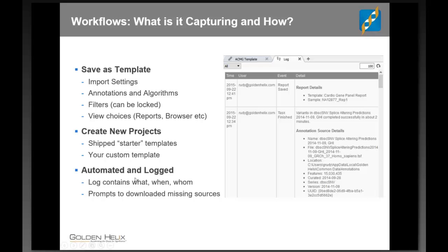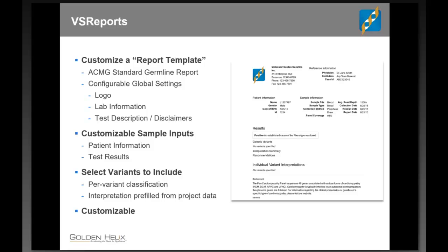Also supporting clinical needs, we have this whole thing logged. Every action, whether automated or done interactively, is logged with when it was done, the logged-in user, and the details of the action, including things like which versions of which annotation sources were used, etc.